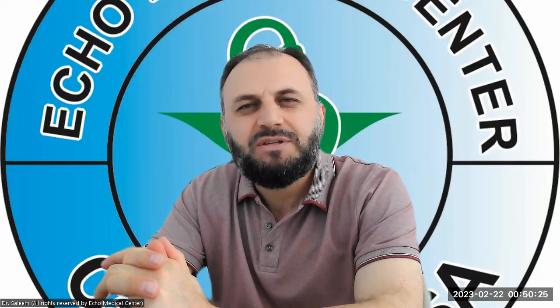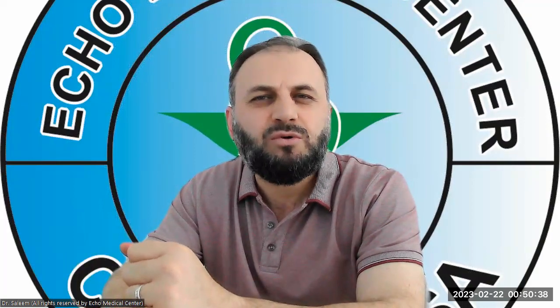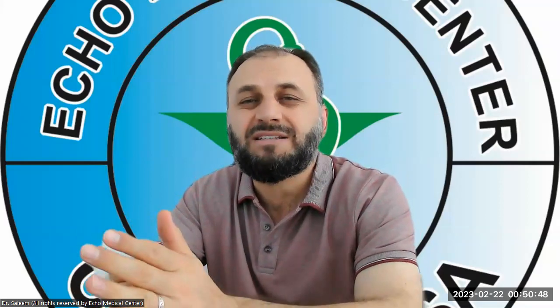Somebody was asking if I could explain a little bit about the international protocol for the cerebrovascular studies, evaluation of the arterial system for the cerebrovascular system. Okay, here is the deal. Everybody has their own protocols. I mean, any radiologist, cardiologist, vascular specialist, or any other doctors related to this field have their own protocol. Some doctors will ask for a short protocol, some will ask for a long protocol. But let me tell you what a standard protocol is, which most hospitals and healthcare providers use.